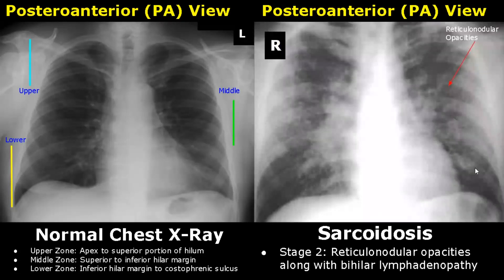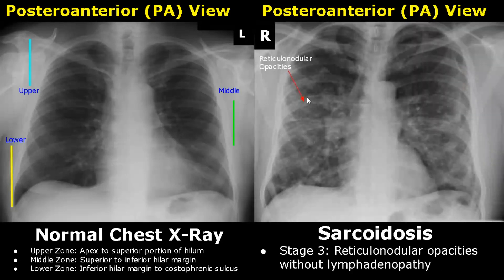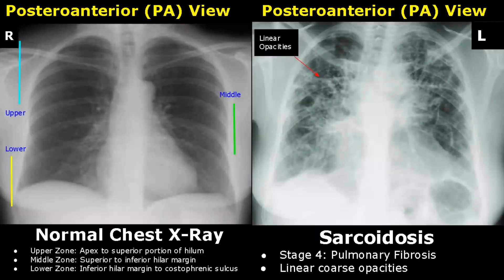In stage 2 sarcoidosis, reticulonodular opacities are found along with bilaterally enlarged hilar lymph nodes. The reticulonodular opacities contain both round areas as well as linear opacities. In stage 3 sarcoidosis, we will not see enlarged lymph nodes — only reticulonodular opacities throughout both lungs. Stage 4 is the final stage; the x-ray shows numerous coarse linear opacities in both lungs, which is a sign of pulmonary fibrosis.